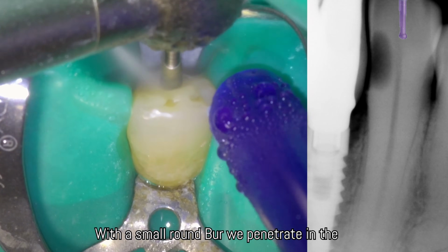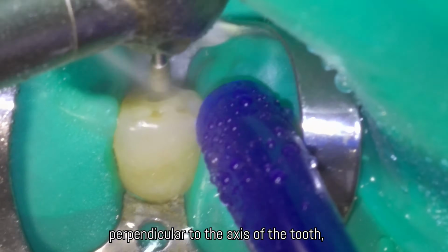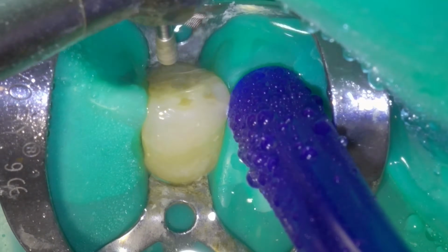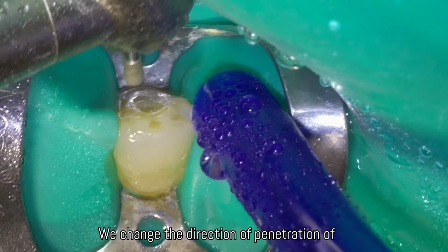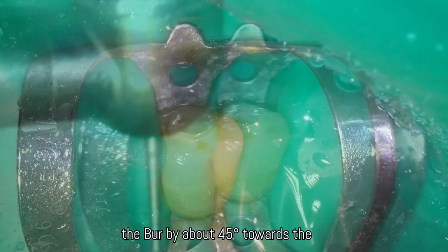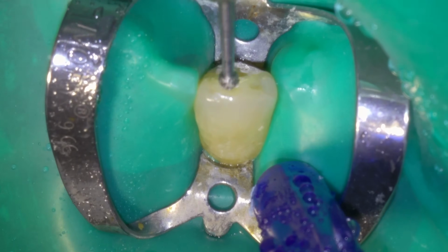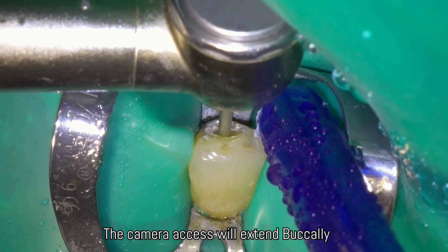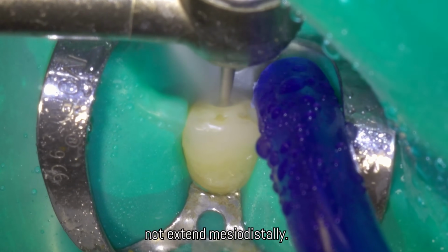With a small round burr, we penetrate in the center of the lingual surface perpendicular to the axis of the tooth about 2 mm or so. We change the direction of penetration of the burr by about 45 degrees towards the apex. The cameral access will extend buccally almost to the incisal edge, but should not extend mesiodistally.